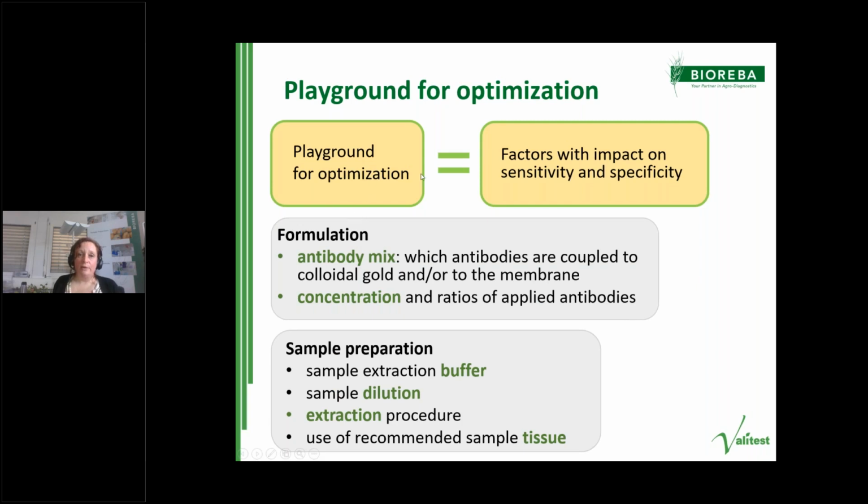What is the playground for optimization? So it's actually the factors that will also impact on sensitivity and specificity.